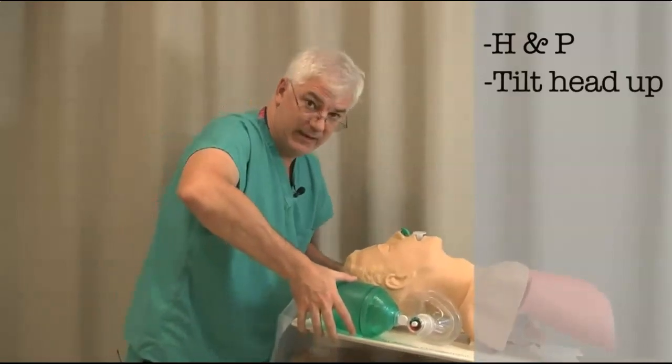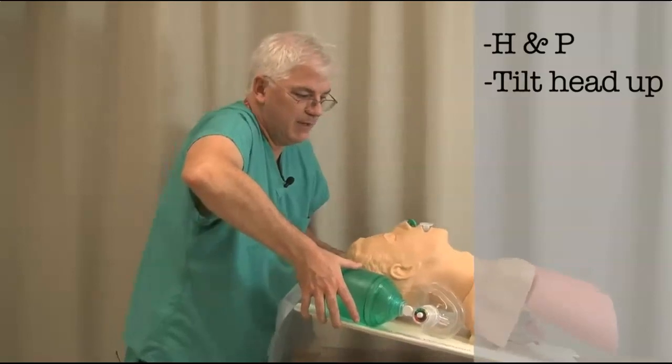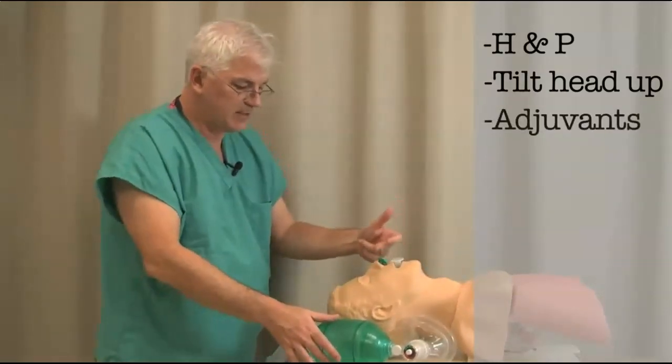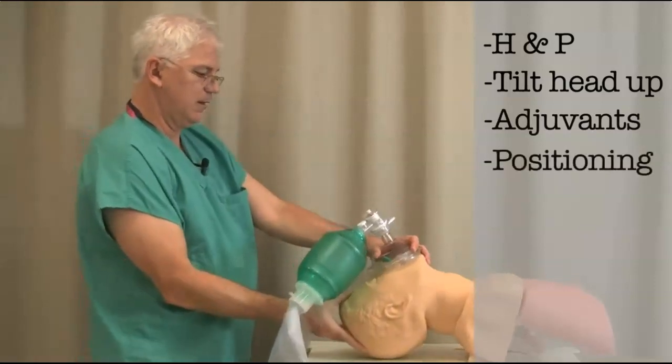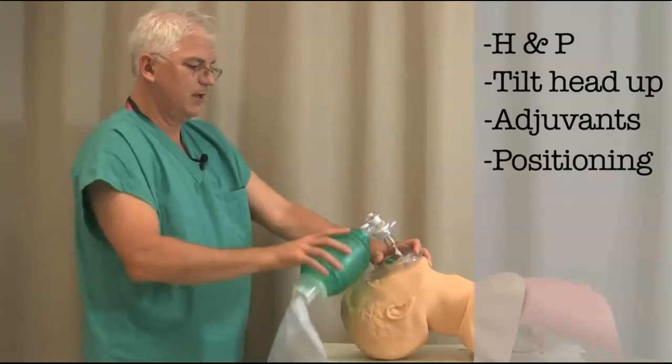Tilt them head up if you can. Obviously, an unstable patient in Trendelenburg, you can't. But if you can, tilt them up like this. Use the airway adjuvants if you need to. Get that, see how I got that head in a good position? Get that head in a good position.